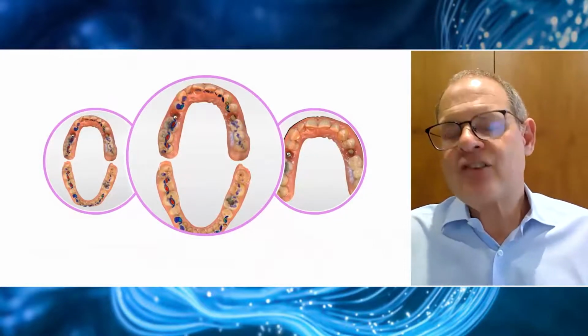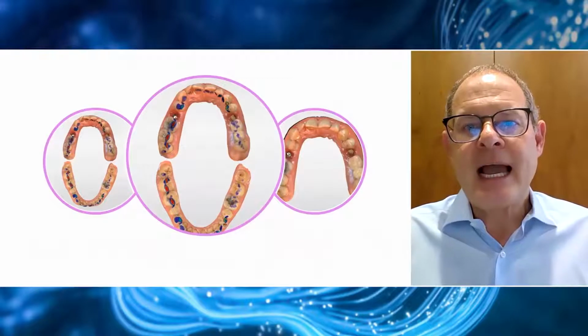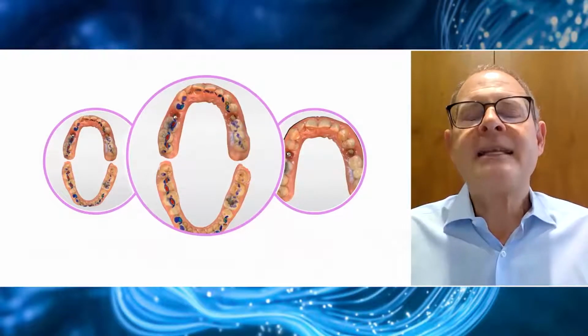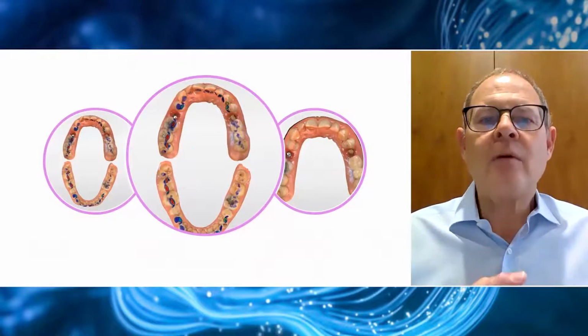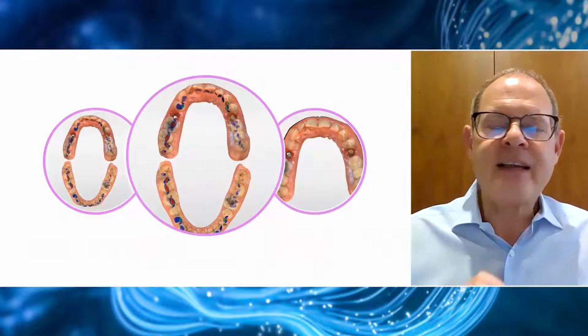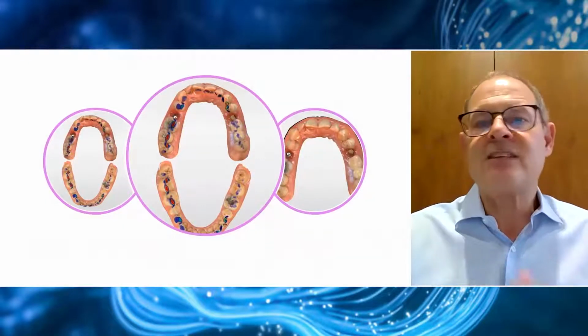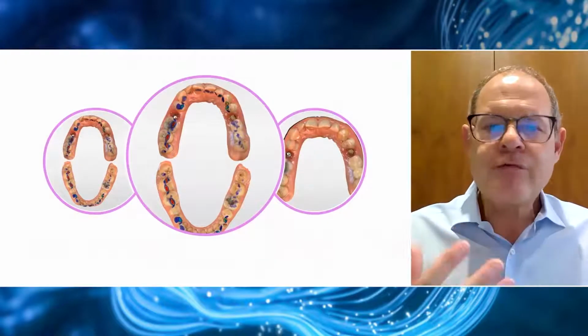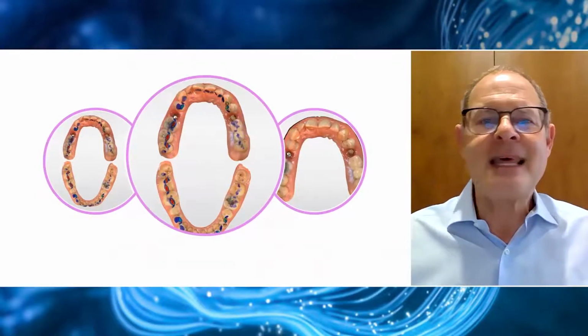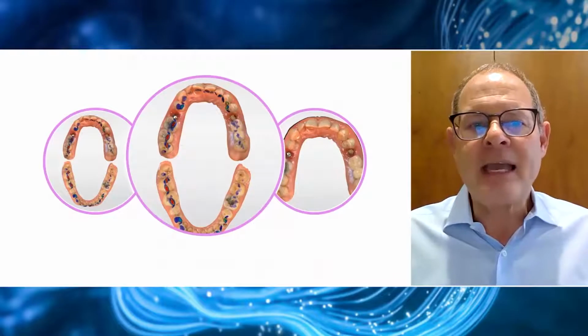I have to say, patients love to see these images, and I think they might help to sell more dentistry in the long term, because they provide a phenomenally good opportunity to point out defects or deficiencies that may exist with existing restorations or with the patient's own teeth. Patients really appreciate being able to see their mouths in this way.